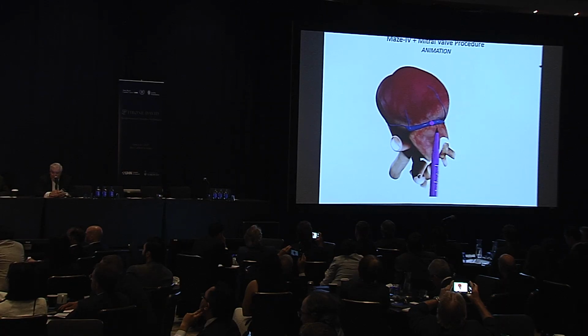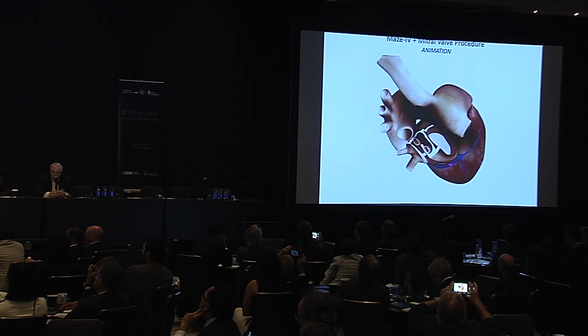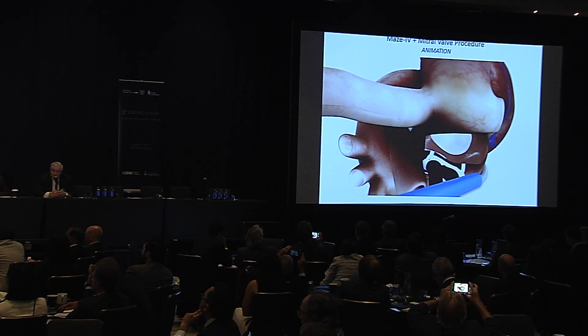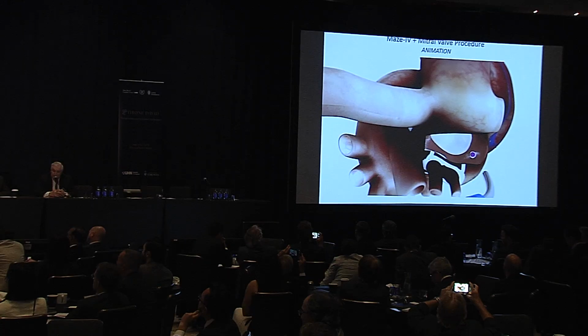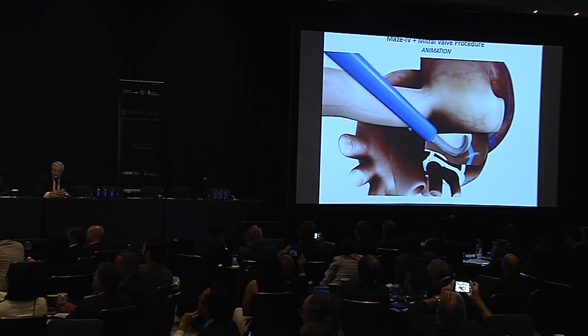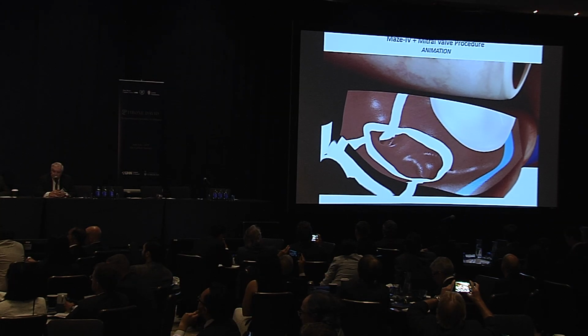You then identify the coronary sinus, the watershed area, and then you put your cryoprobe outside the heart, push up on it, so you see this ice ball come inside the left atrium, mark the ice ball, and then put your cryoprobe from the lower atriotomy across that blue dot down to the mitral annulus. And you're finished.